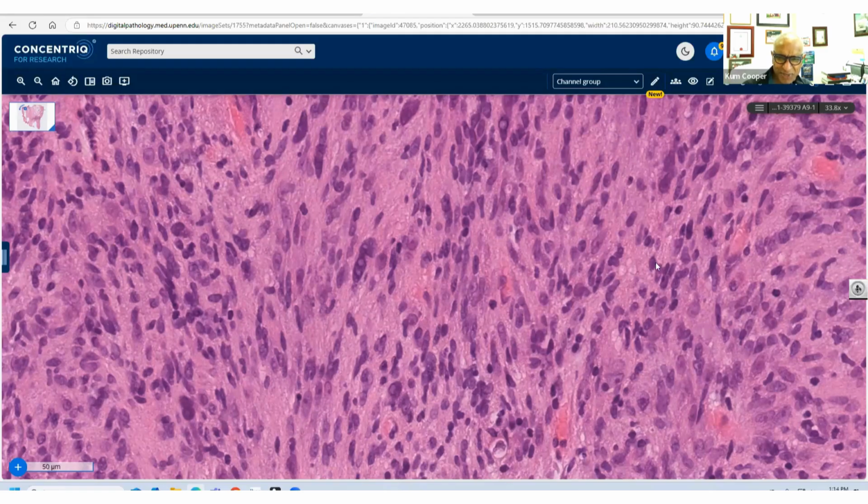But let me answer Maria's question. The muscle marker would only give you differentiation, and in that context, with the MPNST via the NF1 route, would just make it a Triton tumor. There have been people who've suggested that those have a more aggressive outcome. But the muscle markers were negative in this, Maria, just to get that out.